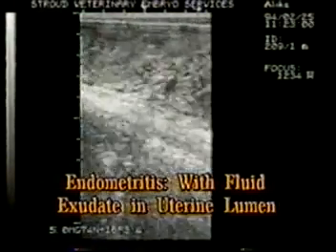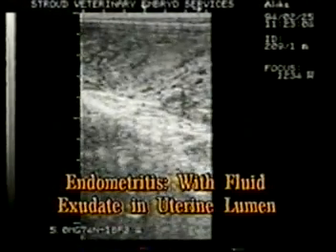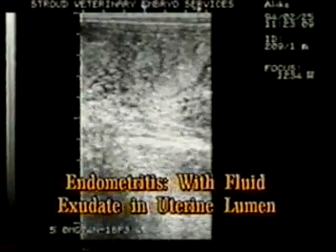This fluid was a chocolate-colored exudate when recovered by a therapeutic flush. The exudate was palpable, but ultrasound enabled the practitioner to diagnose it as abnormal.